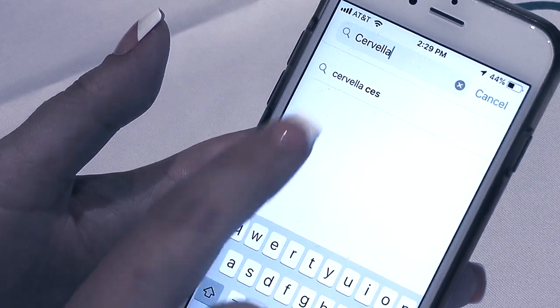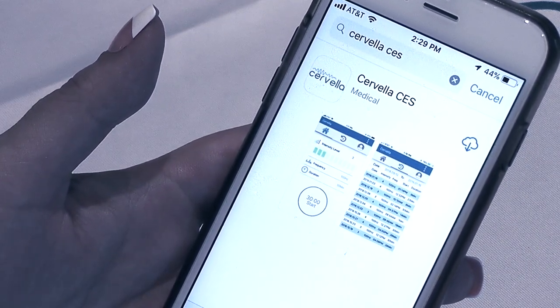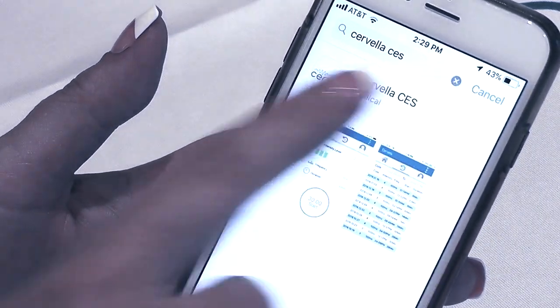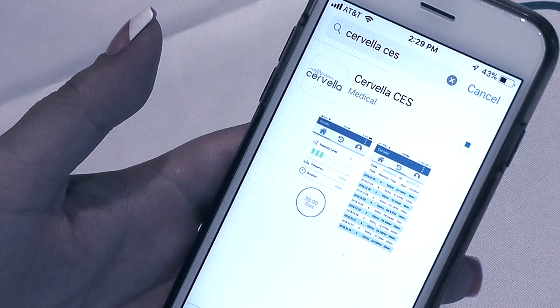Also, verify that the Bluetooth functionality is enabled on your smart device and ensure that you have internet access. Next, start the Cervella app and complete the registration process.